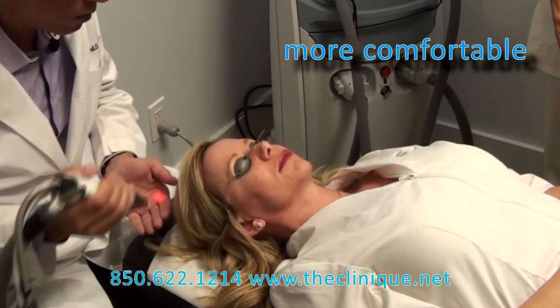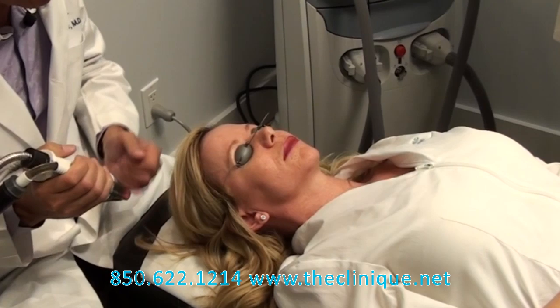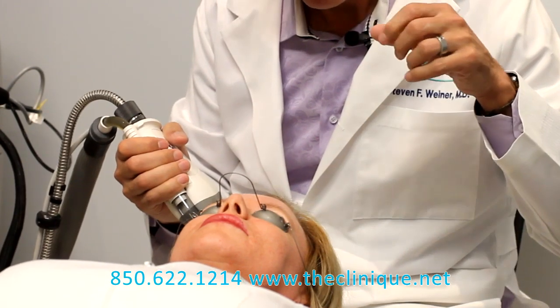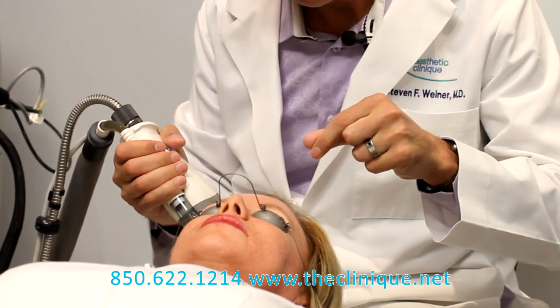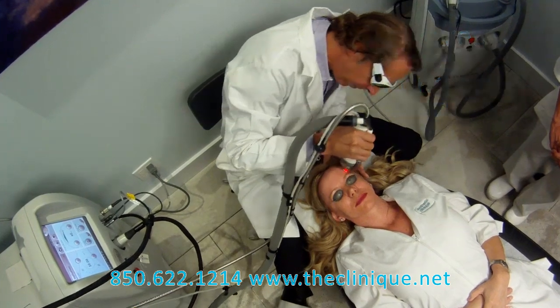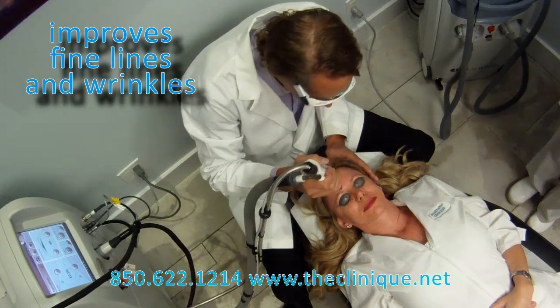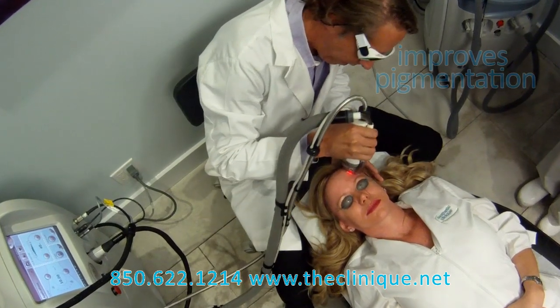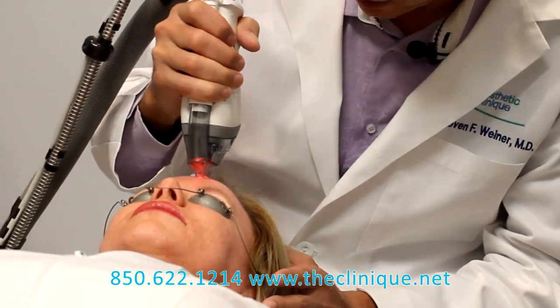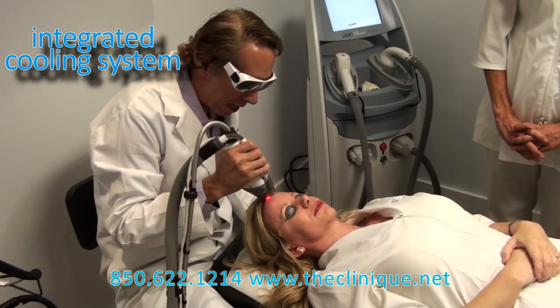What you do is you roll it over the skin, and it releases hundreds of thousands of these heat cylinders that penetrate into the skin. The 1927 wavelength is for mainly pigmentation and superficial resurfacing, and the 1550 laser is for mild to moderate wrinkles, pigmentation, and some skin tightening. It has an integrated cooling system, which the prior Fraxel did not have.